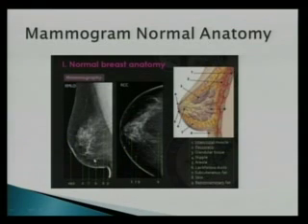And so when we talk about someone with dense breast, you can imagine it's completely white. It's very difficult to interpret because you just have all white, much less black. Obviously, most radiologists prefer to read images where there's a lot more black because it makes the contrast easier. And we should see the muscle, like I said, down to the level of the nipple on the MLO view. Sometimes we'll see the muscle on the CC view as well.